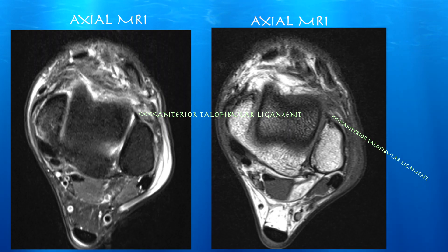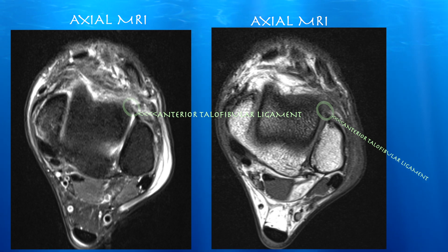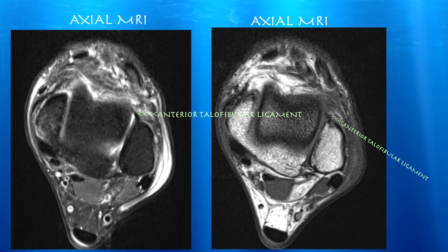Here's an axial MRI taken after the ultrasound, which shows a high-grade tear of the distal attachment onto the talus of the anterior talofibular ligament. Based on the MRI, there are some fibers remaining in this ligament — mostly distally the ligament was torn, but you can see some proximal fibers remaining on the MRI, which were not clearly visible on the ultrasound. Perhaps some shadowing from the osseous fragment made it difficult to see those proximal fibers of the ligament.